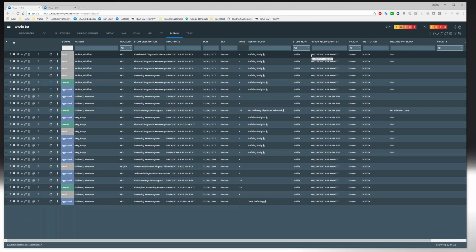You can use a much more pedestrian workstation as long as you've got an extra 5-megapixel monitor laying around and you've got a video card capable of driving a couple of monitors and 5 megapixels at that. That's really all you need. We use much less memory and processing power than other systems do. So that's a very good question. Thank you. Any other questions?